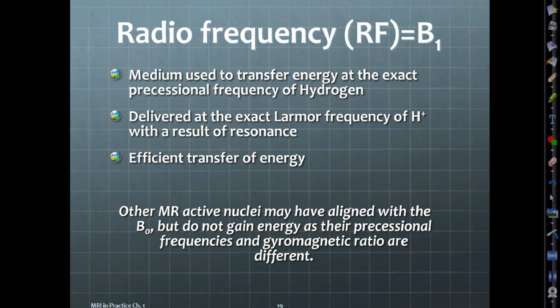So what's going on there is really, when you hit that tuning fork, they're not touching, but those waves are resonating at the same frequency, and that other tuning fork will start to vibrate. And that's called an efficient exchange of energy in that scenario.